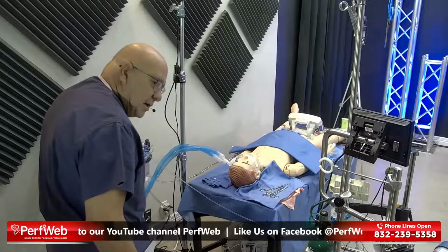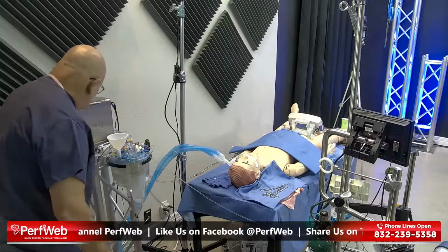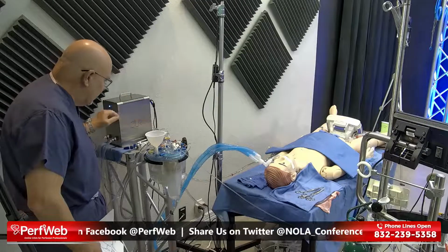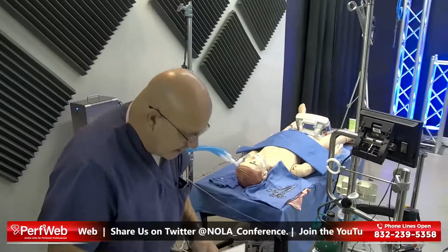So everything, there you go, is connected here to the, step back, to the ECMO simulator that you see. It runs off of an iPod. So the lines are coming in, going out. I have a reservoir here for doing various things. Okay, that's fantastic. Thank you.